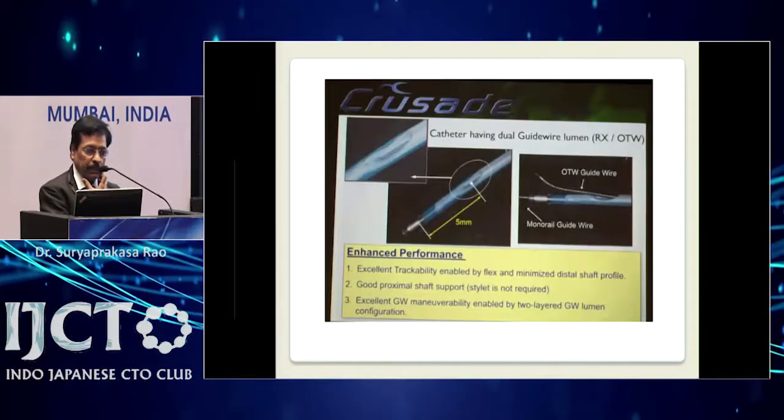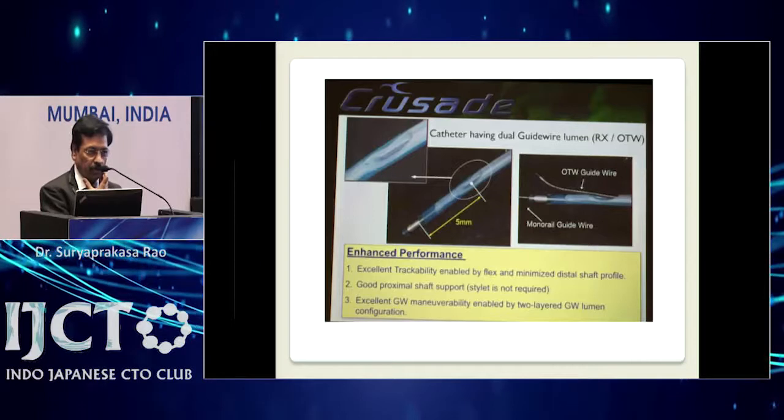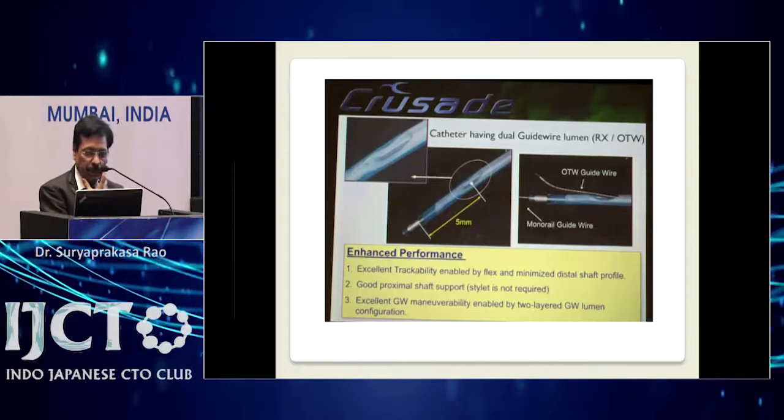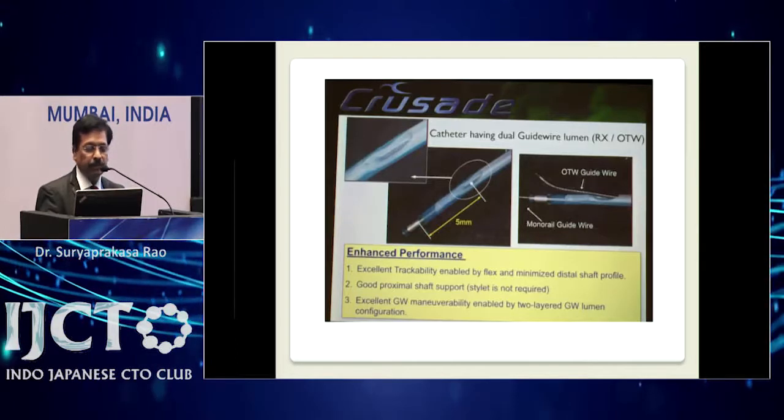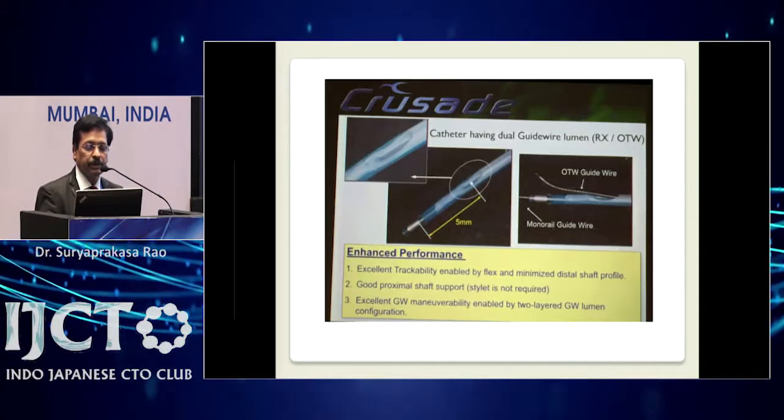And the Crusade catheter nowadays is very useful to give support and to have access to the side branch. The advantages of the Crusade catheter have been elaborated already.